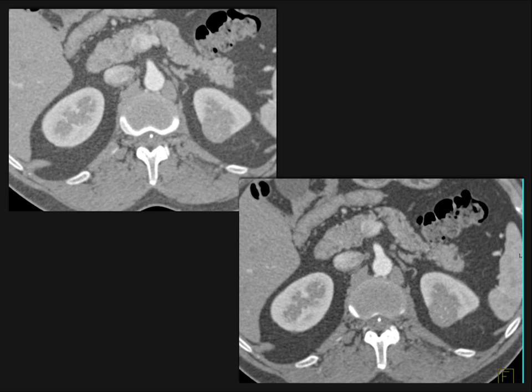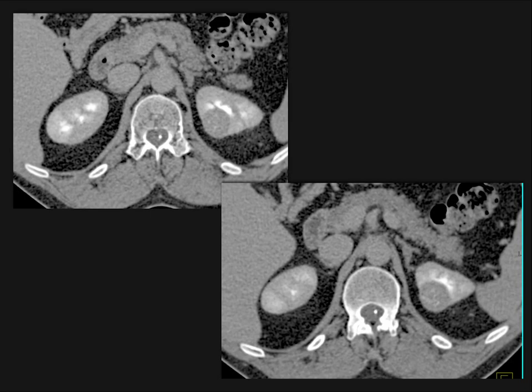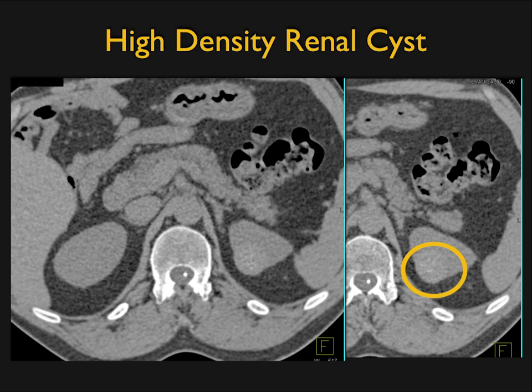You can see the challenges. A lesion that looks solid may turn out to be benign — remember, 25% of renal masses resected under 4 cm are benign, in part because of cases like these. If you have only the excretory phase and the values are exactly the same across multiple phases, you should think high-density renal cyst, because lesions enhance and wash out — values are never identical across phases. When they are, there's no enhancement; it's a high-density structure. We went back, got a non-contrast scan, and confirmed the left kidney lesion was a high-density renal cyst — not a tumor, and this patient did not need a partial nephrectomy.